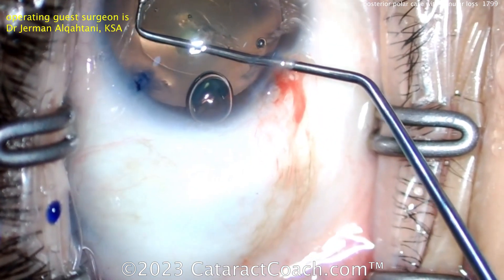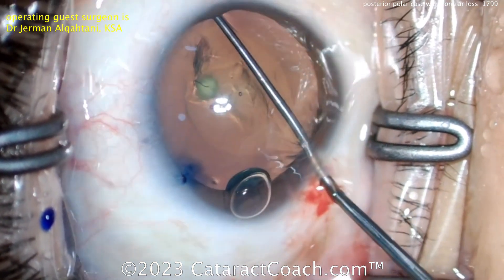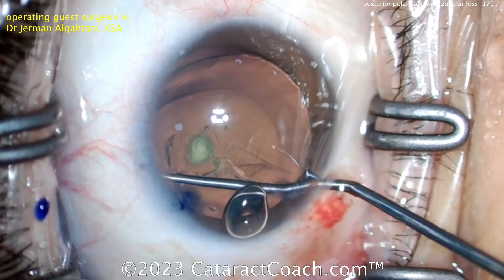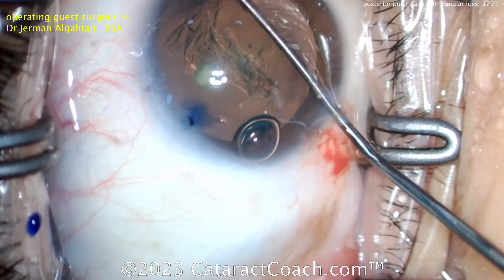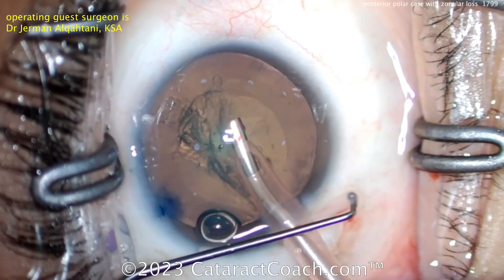Now using just a hook or a chopper to get under the capsule and maybe dissect it away. This is a technique that can be done to help loosen things up.